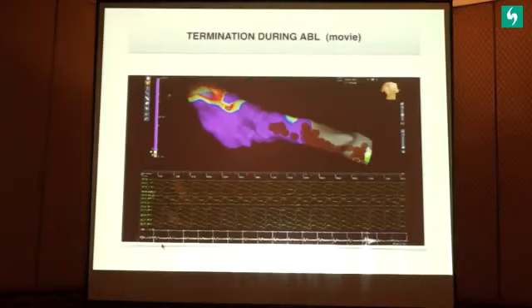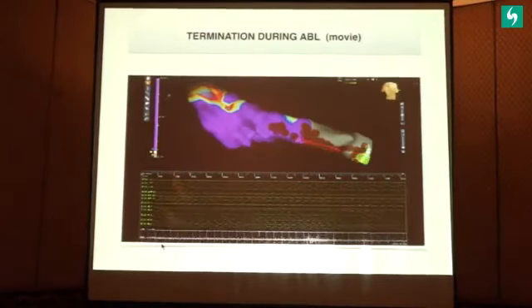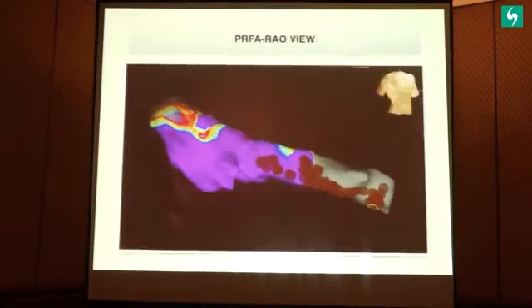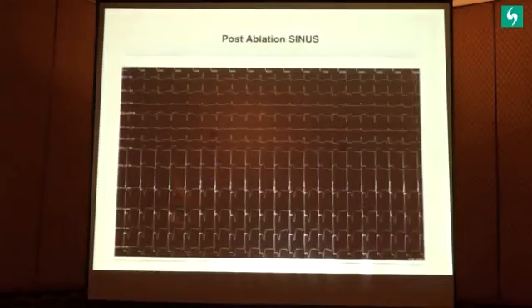So we mapped here. This is a 3D map. So it's non-fluoroscopy, so there's no fluoroscopy here. You can see the catheter as a green dot. So this is the catheter which is moving. And this is giving an ablation current here. These dots are ablation. So I'm drawing a line and completing the line up to the apex. And this VT terminates with this ablation. You see this VT goes away. And this is the same frame, the VT during ablation goes away at this point of current.